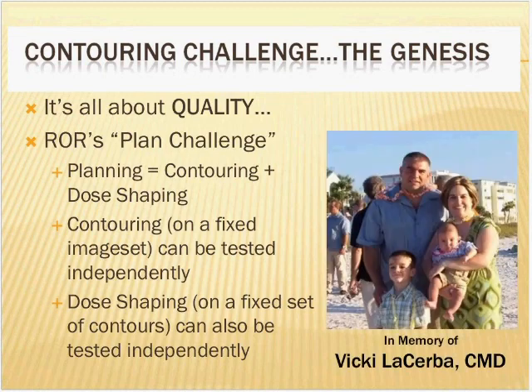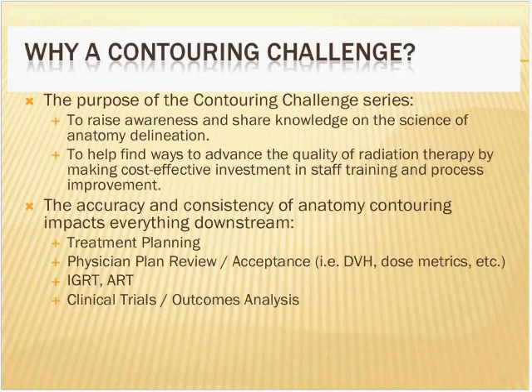The genesis of this, as Greg mentioned, was really the plan challenge, and I want to bring up Vicki again. She's a good friend of mine, and I remember the first plan challenge she did was several years ago, and I remember having the conversation with her that said, well, the plan results you see, a lot of the variation is going to be due to how they draw the organs, and some of the variation is going to be due to their different planning techniques. And if we were really going to do a good experiment, we should split out the contouring from the planning. Whenever we do a contouring challenge, I always think of Vicki, because this was really where the idea for the contouring challenge was born, in that we are studying only the contouring variation.